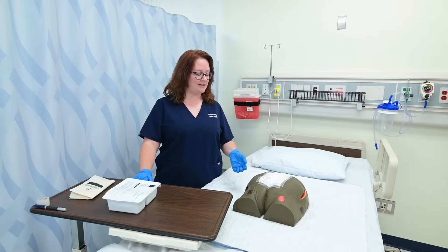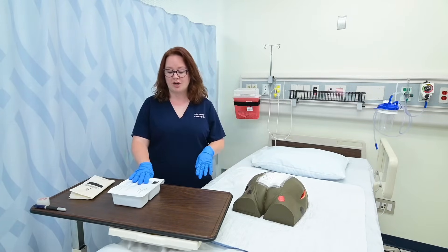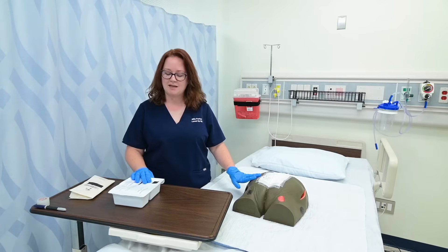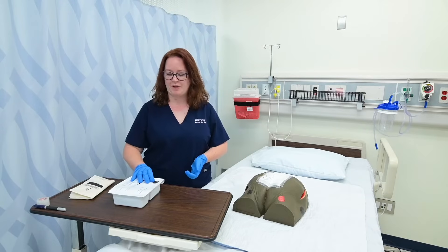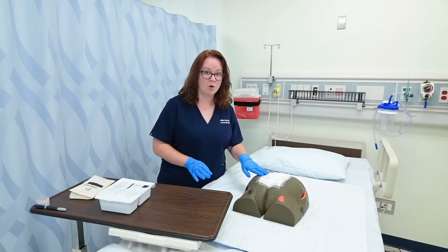To prepare to change my patient's dressing, I've already washed my hands and gotten gloves, and I've gotten a wound care tray. These trays come with everything that I need to change this patient's dressing using sterile technique, but I may need to get a couple of things as well, depending on the facility that I'm in. So before I open this and prepare all of my sterile things, I'm going to go ahead and remove my patient's old dressing.